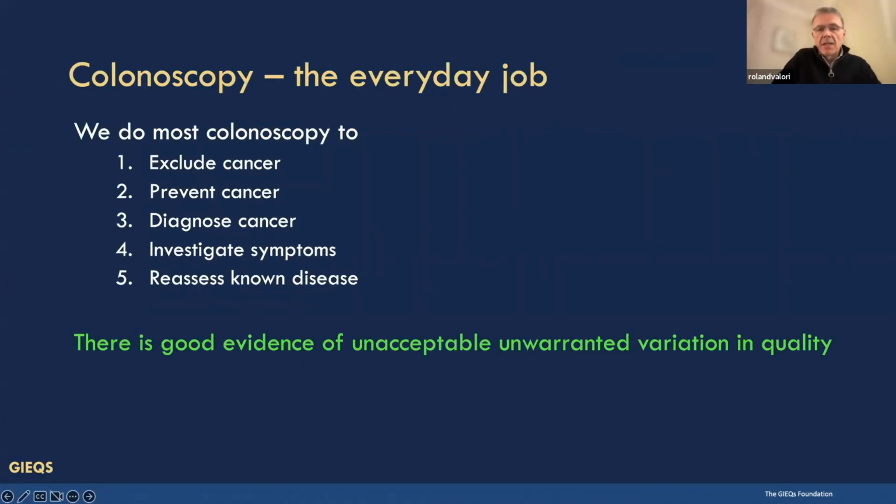Thank you very much, David. I would like to just start by making the point that most of the colonoscopy we do is about cancer, about finding cancer or excluding it and definitely preventing it. Next slide.